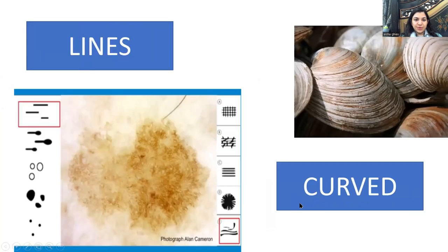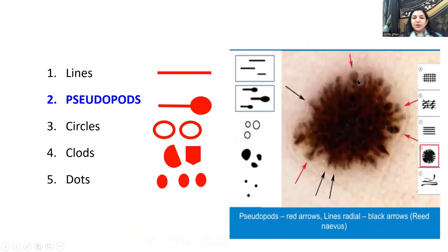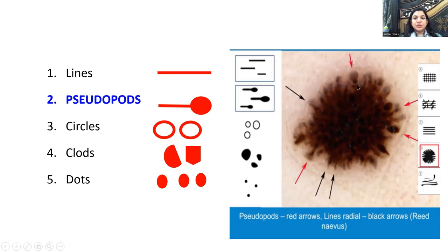The second basic structure is a pseudopod — a line ending in a bulbous structure. In this example, the red arrows point to pseudopods: globular at the periphery, going inside as streaks or lines. The black arrows point to radial lines. Since pseudopods are present throughout the entire periphery of the lesion (not focal), this is a Reed's nevus.